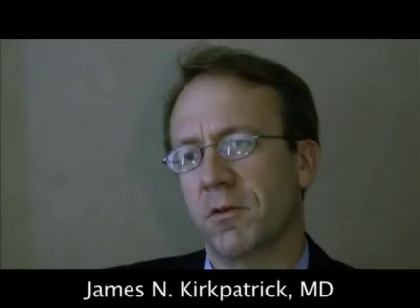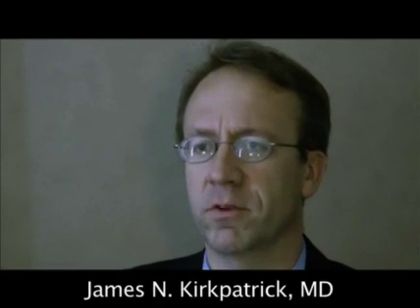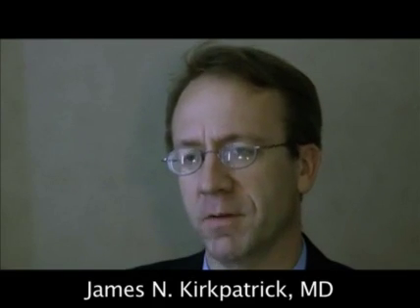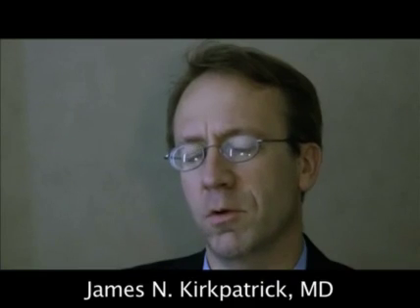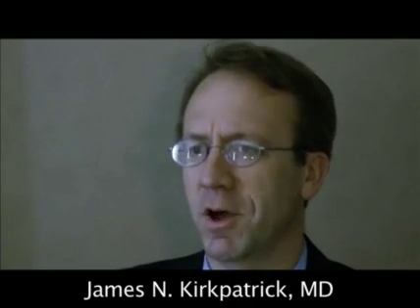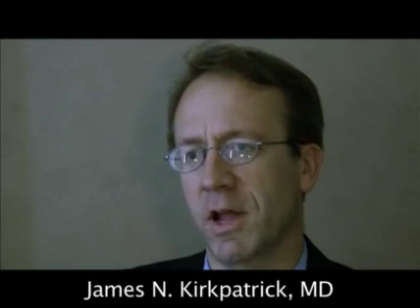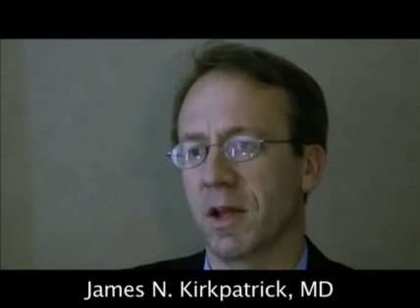My name is Jim Kirkpatrick, and I am an assistant professor of medicine in the cardiovascular medicine division at the University of Pennsylvania. Today I would like to talk to you about echocardiography and cardiac masses. Now, I'm not going to be talking about a comprehensive look at cardiac masses, but rather echocardiography, its use in diagnosing cardiac masses, and some of the important things about masses that relate to echocardiography.